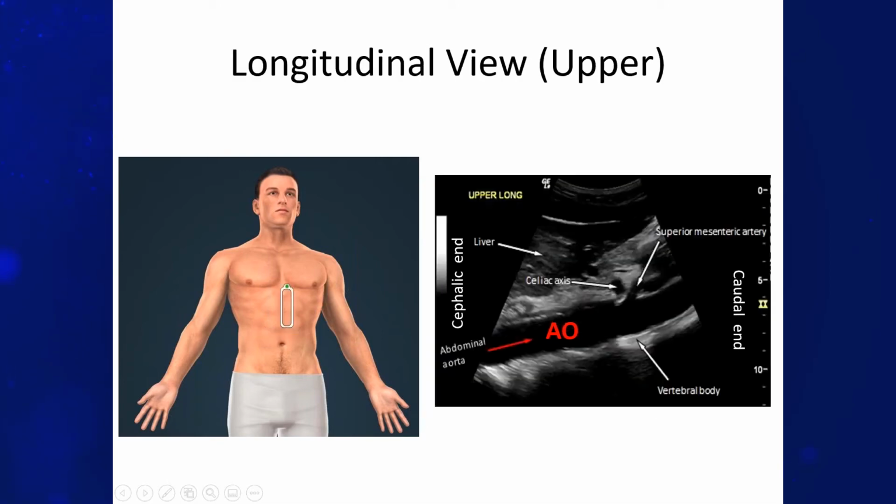We also have to get the corresponding long axis or mid-long axis view through the middle of the abdominal aorta. How we know it's when we just sweep the probe side to side along the aorta, we will notice that you will start seeing the intima and the media adventitia. When you see that, then you know clearly that is going to be your mid level, because that's when you'll be able to see these layers of the wall of the aorta very clearly. And of course, this is the spine, these are vertebral bodies and its vertebral disc spaces.